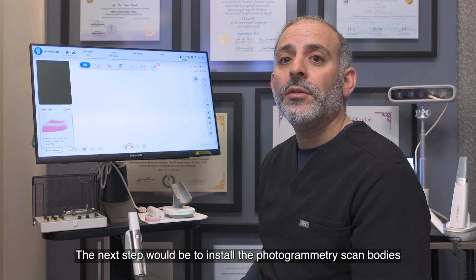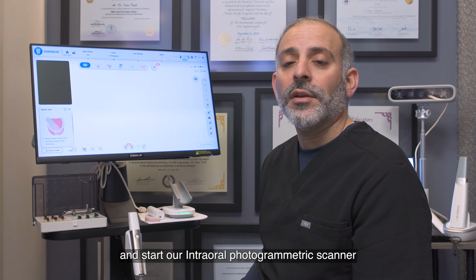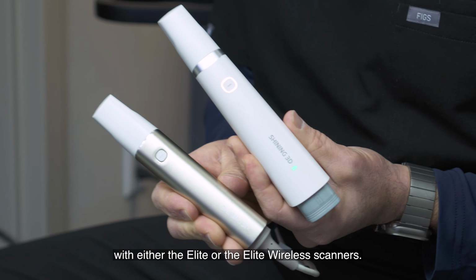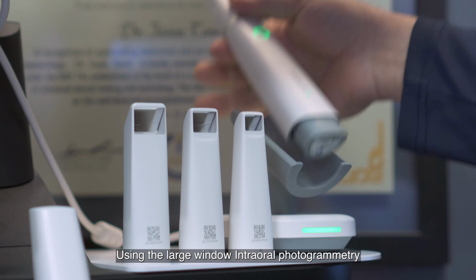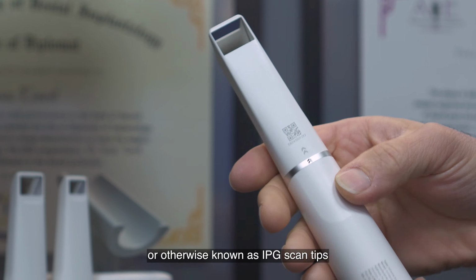The next step would be to install the photogrammetric Scanbodies and start our intraoral photogrammetric scanner with either the Elite or the Elite Wireless scanners, using the large window intraoral photogrammetric, otherwise known as IPG, scan tips.